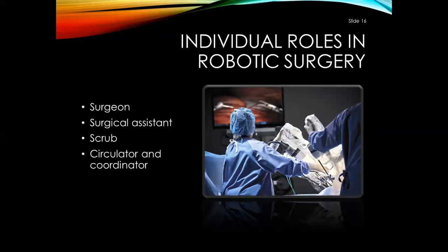The scrub is familiar with the operation of all electronic and vision components, assisting in registration and white and black balance. He or she may also operate the clutch arms and, at the close of surgery, help retract all the instruments. The circulator directs all the scrubbed and non-sterile staff during surgery. So that's the duties of all of these people. So you do play a good part as far as robotics. You don't just stand there like some people probably have told you, okay?